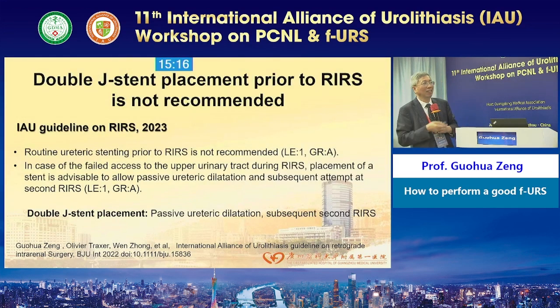And just now, before flexible ureteroscopy, do you need to put in a DJ stent beforehand? Actually, according to the guideline, no need. But sometimes you cannot pass the scope, so you can do it.